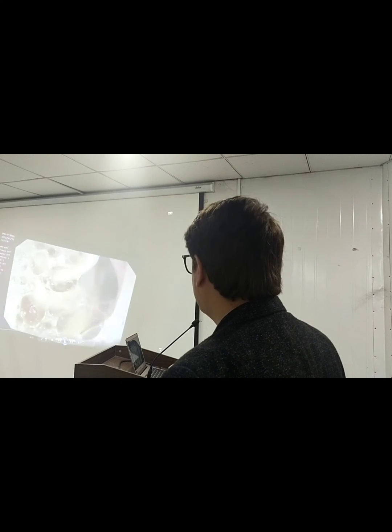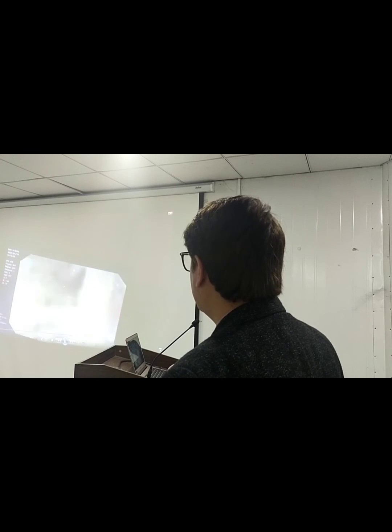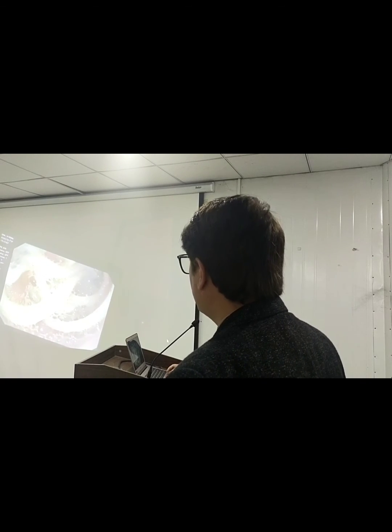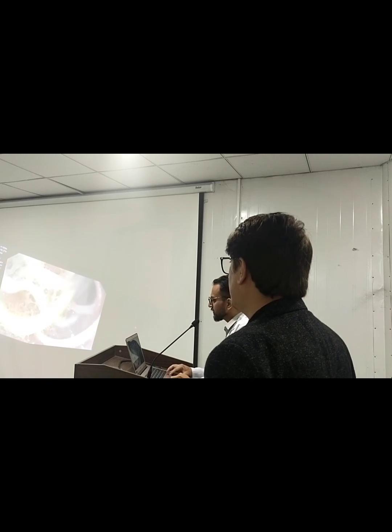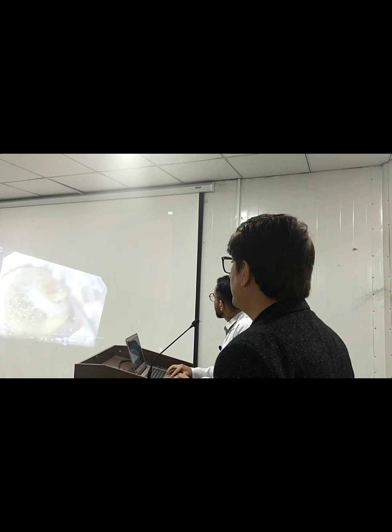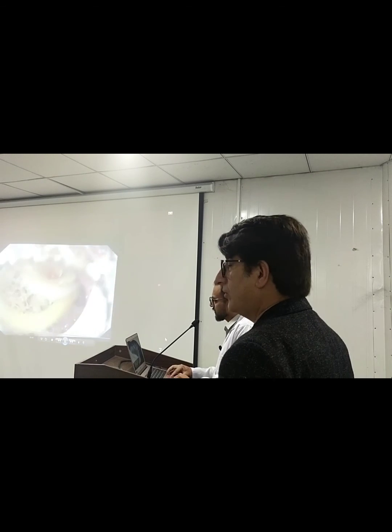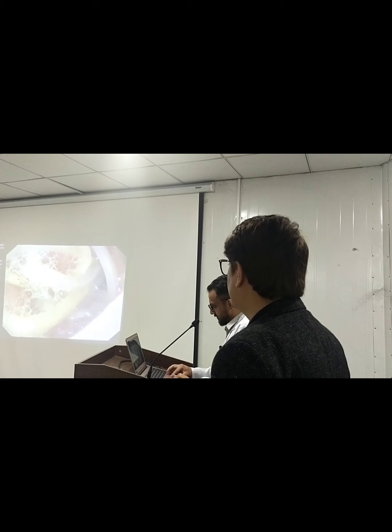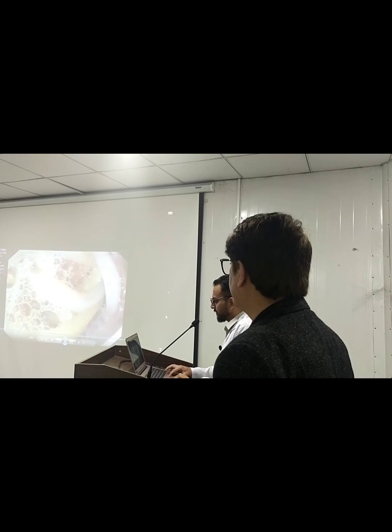The mobile worms. Usually if there are 5 or 10 worms, we are unable to pick them one by one. So the one that is stuck in the CBD, we detect and remove, and the rest of the worms we deworm the patient. They usually die after we administer the anti-helminthic drugs.